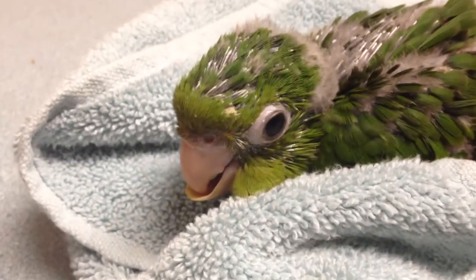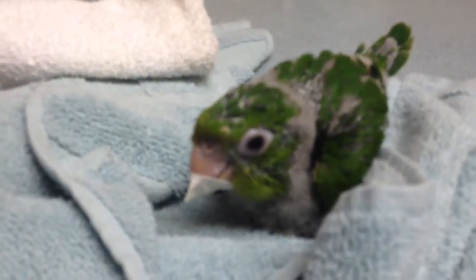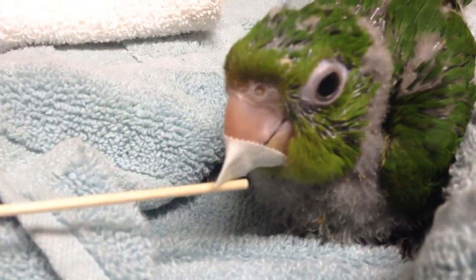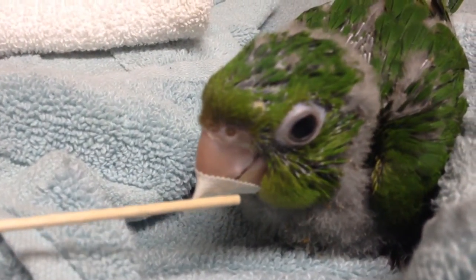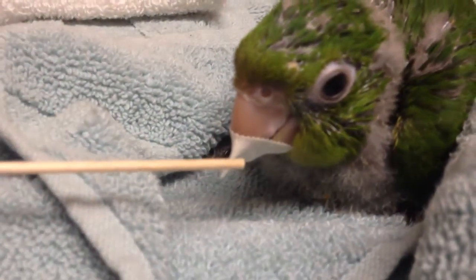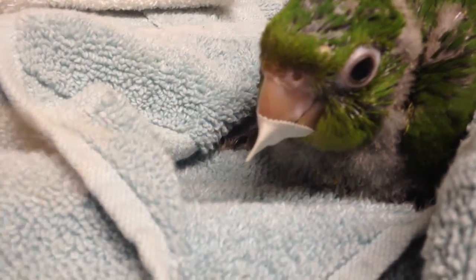All right, now it's phase one - on to phase two. What we've done is we've trimmed the bottom beak and I've actually put the beak in place. This guy's got a full crop, so this always makes me nervous to do something like this. But we're actually going to go ahead and tape it, and it's easy enough to do. As you can tell, this guy's so stressed out.